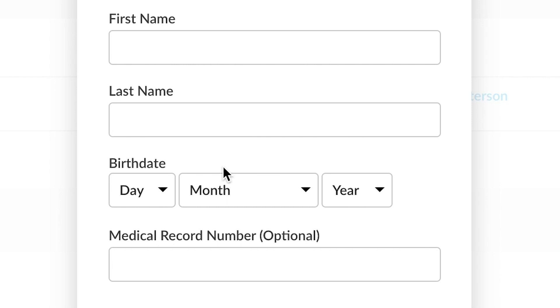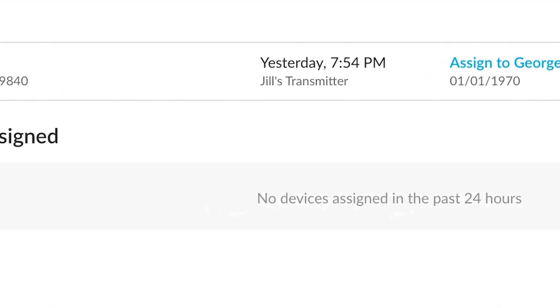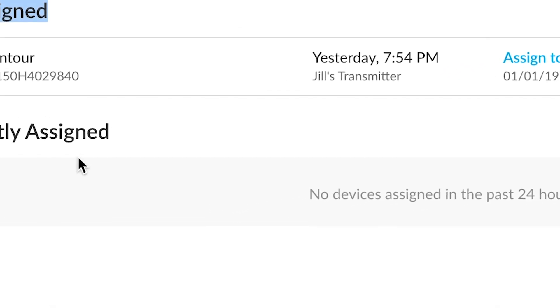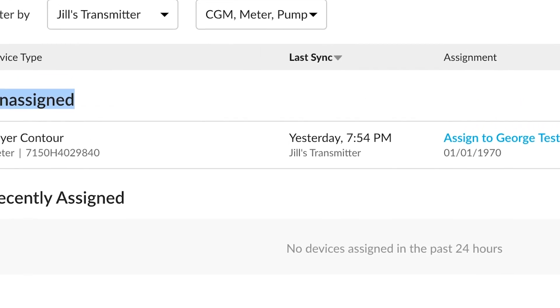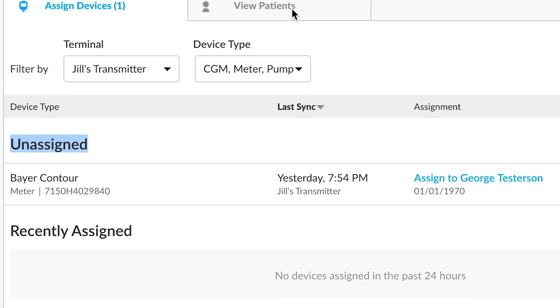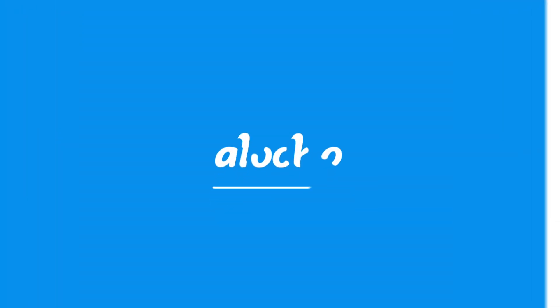We'll have a first name, last name, date of birth, and a medical record number. If we were to fill these out and say Continue, you would see this record then move to recently assigned. If we were to find that patient we just created in View Patients, that data from this Bayer Contour would now be assigned to that patient.